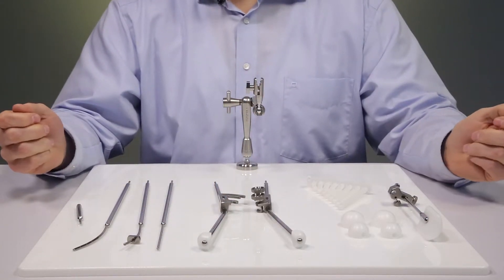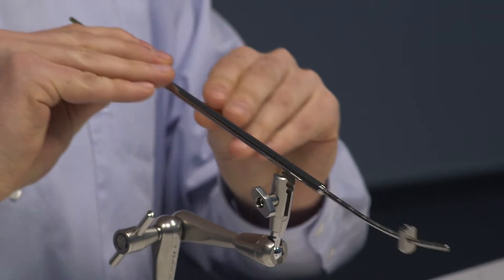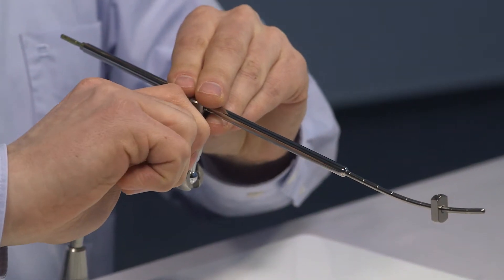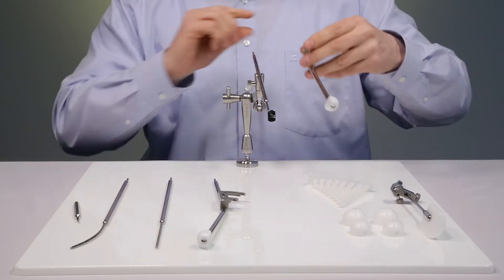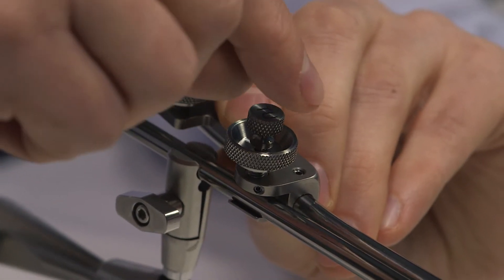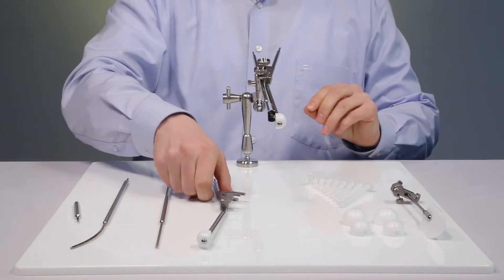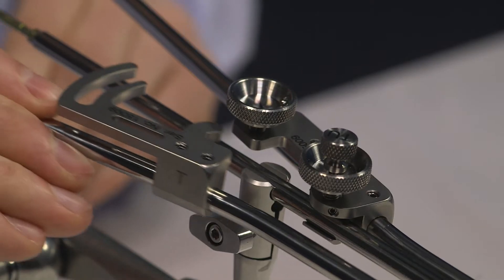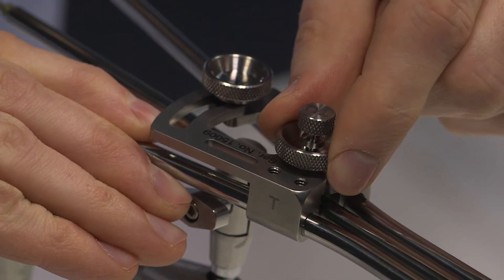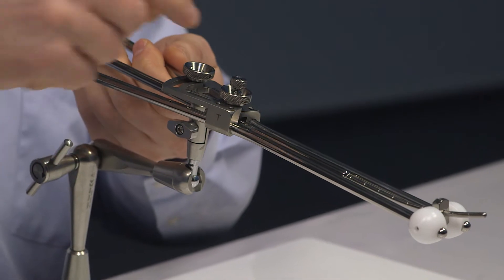Now the assembly is complete and we can start the insertion. The intra-uterine tube is inserted first. For demonstration purposes I will do this without a cervix model. Now the right ovoid tube is inserted and fixed on the I-O tube with the upper front screw. Now the left ovoid tube is inserted and fixed with the lower front screw. Once the desired angle is defined, it can be locked into place with the third screw.